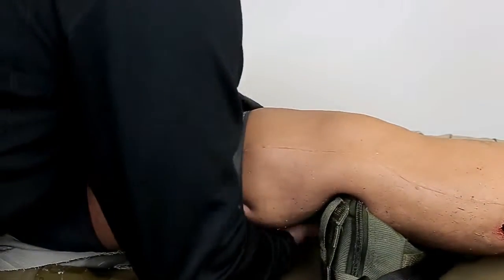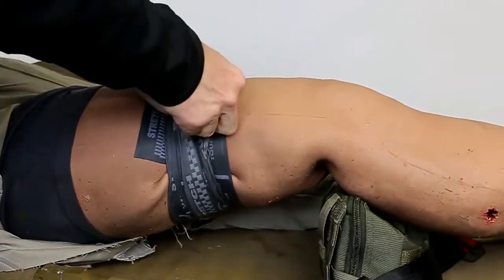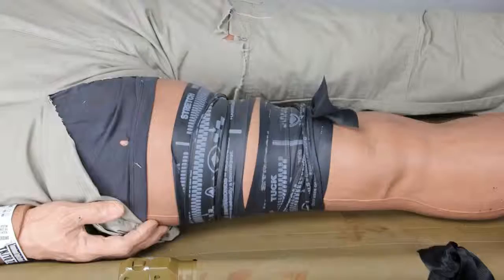Never remove a functioning tourniquet simply to straighten a twisted or bunched up section. In the unlikely event that bleeding continues, a second SWAT-T can be applied above, below, or directly on top of the first SWAT-T. Do not remove the first SWAT-T in order to apply the second.